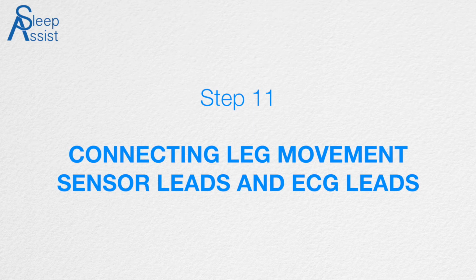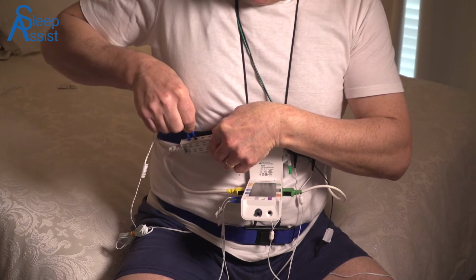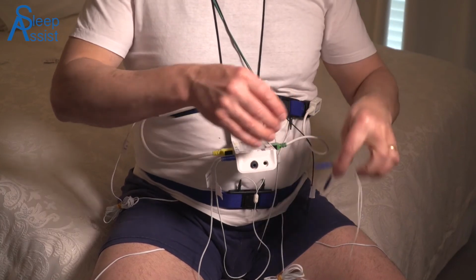Step 11. Connecting the leg movement sensors, leads and ECG leads. Locate the two white leads from the ankle straps and insert them into the multi-lead port box marked left leg and right leg. There are two connectors for each leg.